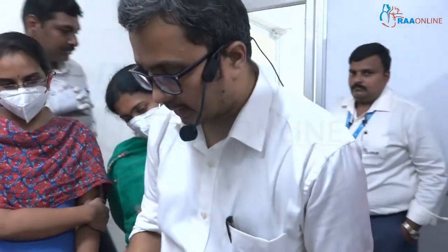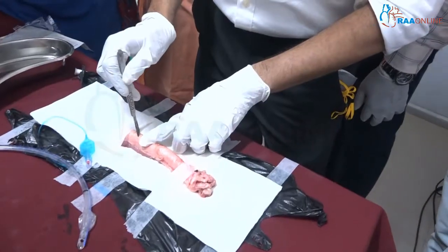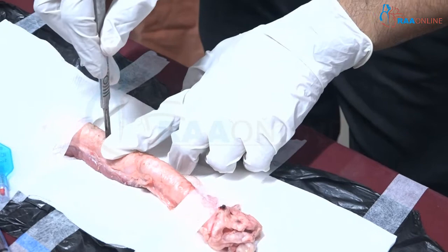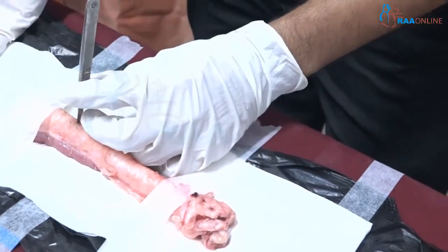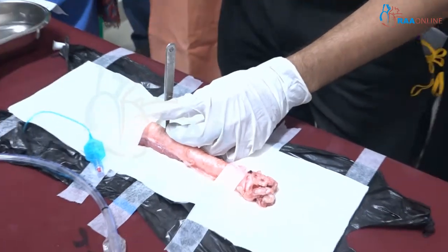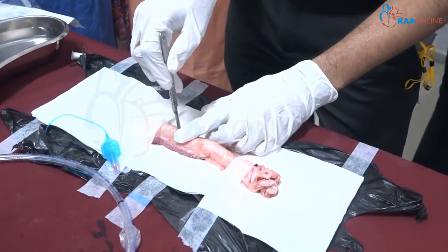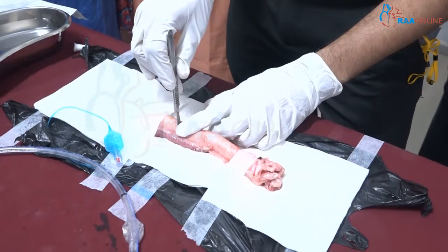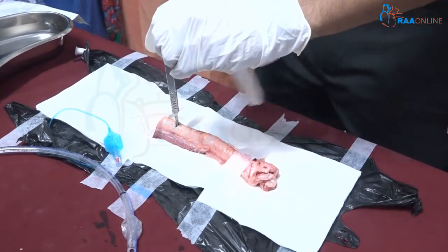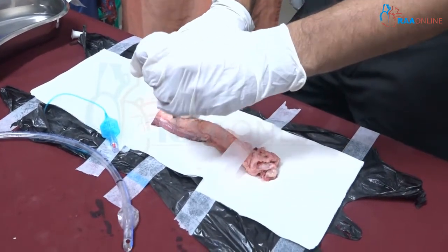Palpate the cricothyroid membrane. Take the blade and make a transverse stab incision. Consider the head end is here and foot end there — we are standing on the left side. Make a transverse incision over the cricothyroid membrane, then rotate it with the sharp end facing downwards and lateralize.